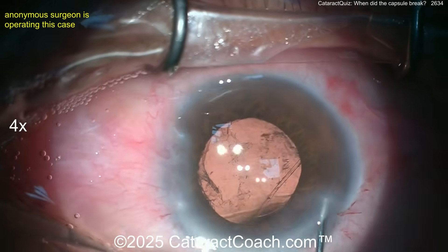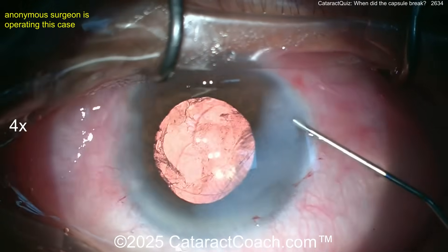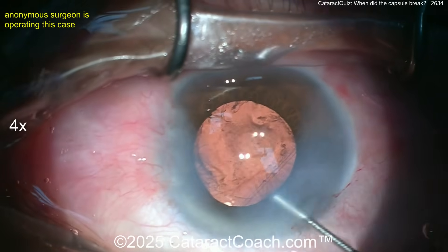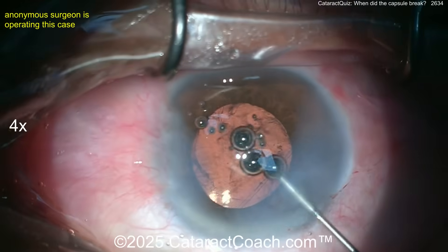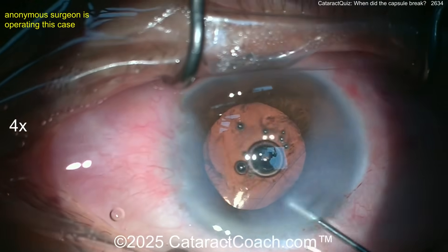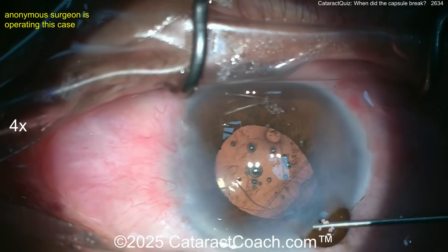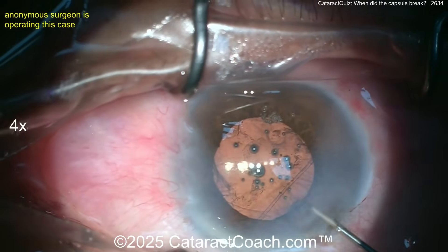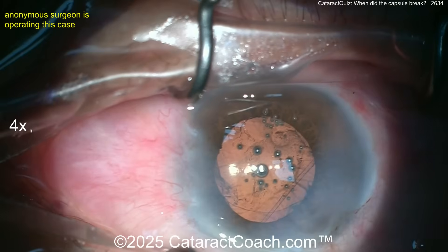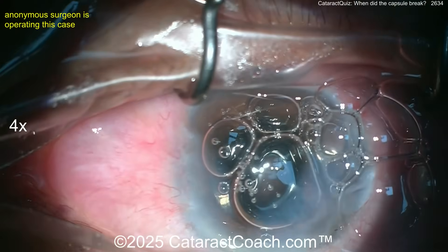Don't forget to bring the pupil down with Miochol. Now hydrate the incisions — put a suture in. You cannot risk a flat anterior chamber if the patient rubs the eye. BSS squirting washes out viscoelastic, but I'd make a second paracentesis and do a bimanual — I don't want to wash out Miochol. Don't pull the iris out; think about the pressure gradient — you can trap BSS behind the iris. A suture here makes life much easier.